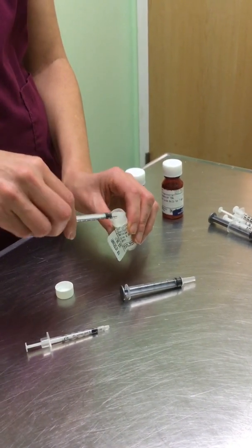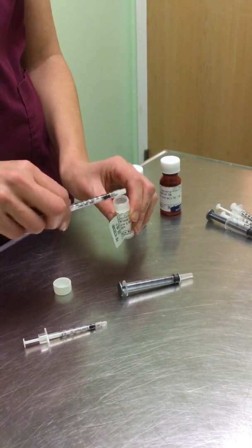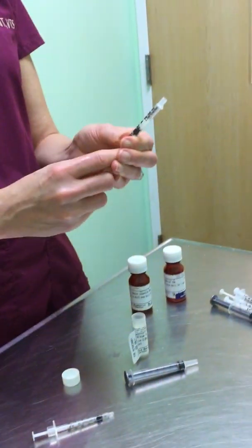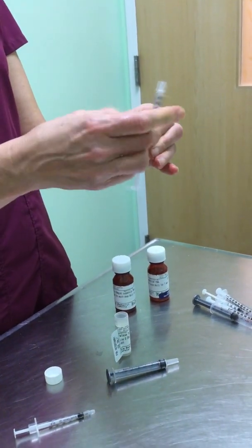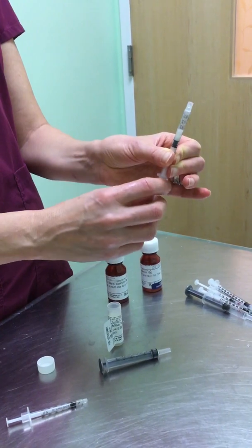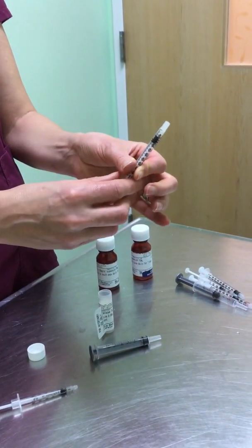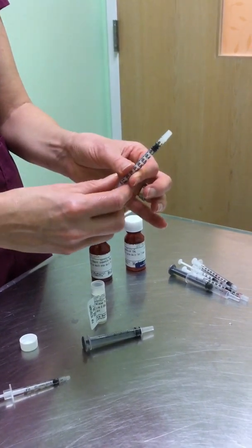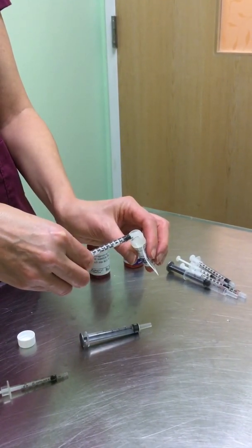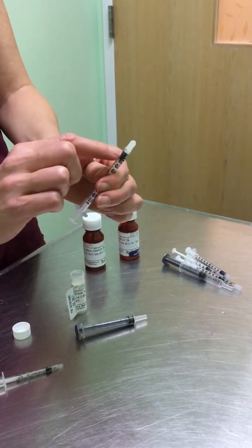So if that were the amount we were going for, again, I'm going to move my plunger back and forth to get some air out if I can. And then I'm going to tip this up. If you do have a lot of air in your syringe, you can also tip it upside down, tap out the bubbles like this to get the bubbles to the top. You will have a little wastage if it spills out, but at least you can see now I don't have any bubbles. And then I'll just squirt very carefully out the amount I don't need until I'm left with 0.05.